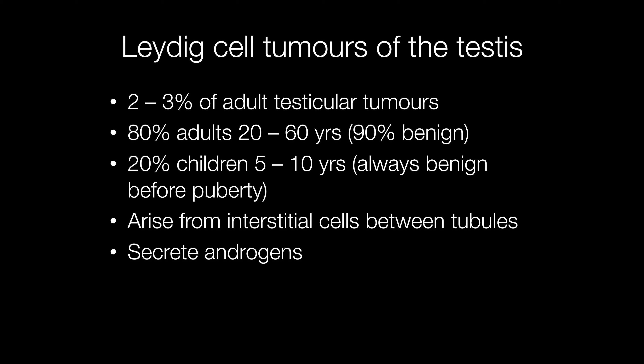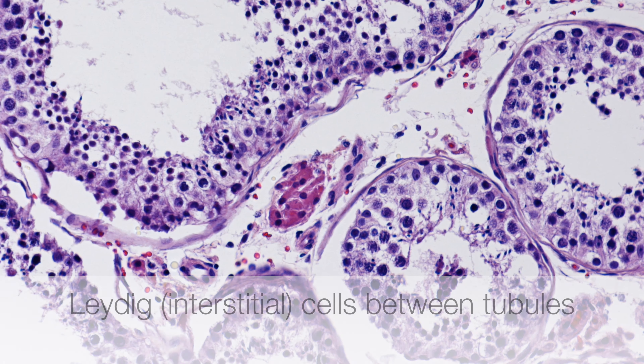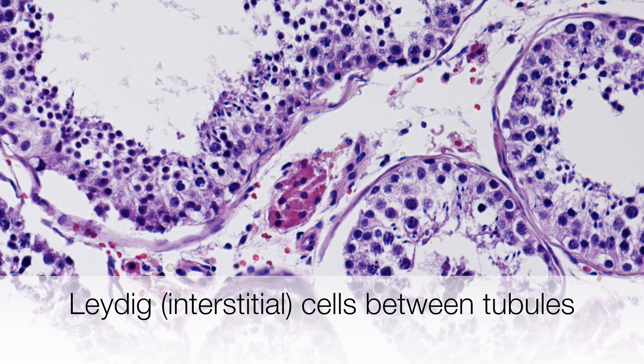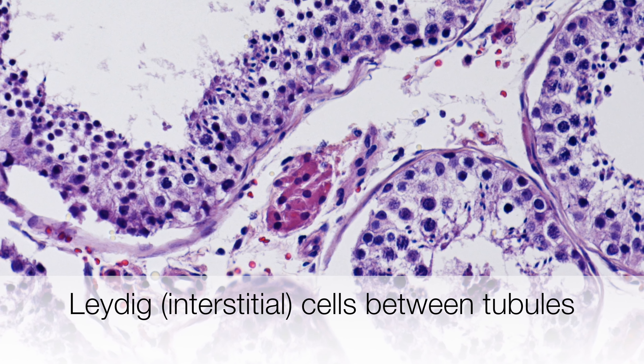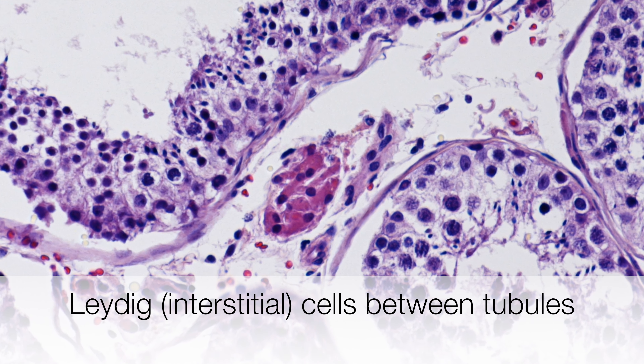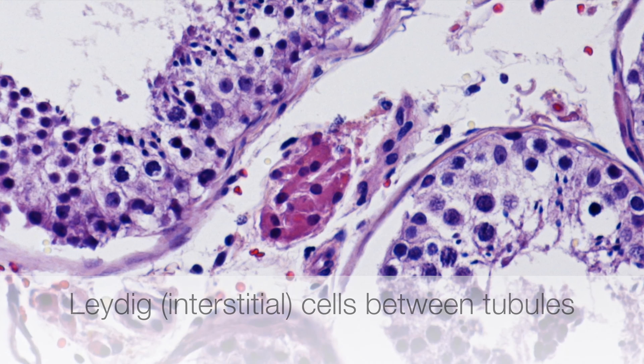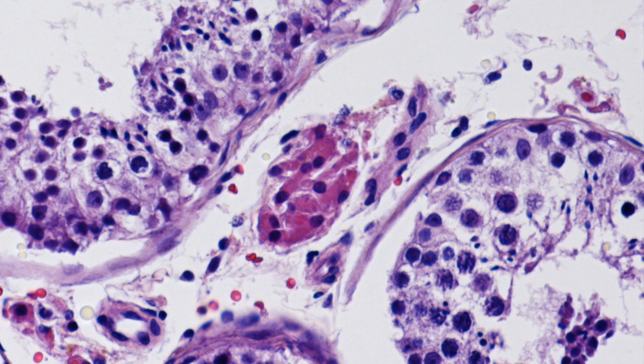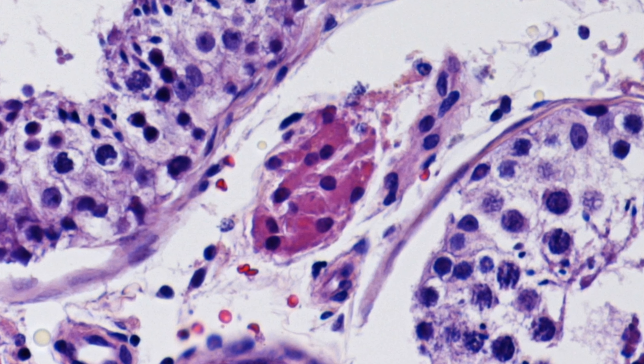Leydig cell tumours belong to the sex cord stromal group of tumours. They secrete androgens and arise from the interstitial cells between the tubules. The pink staining cells we are zooming into between the tubules are normal Leydig cells, also known as interstitial cells or interstitial cells of Leydig.